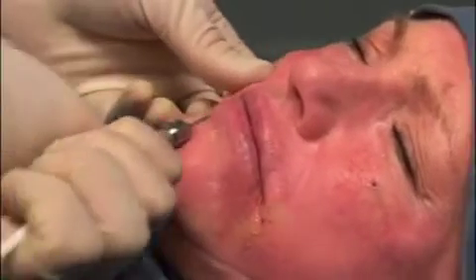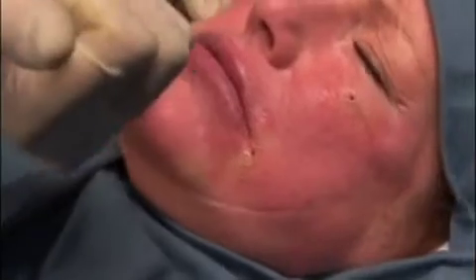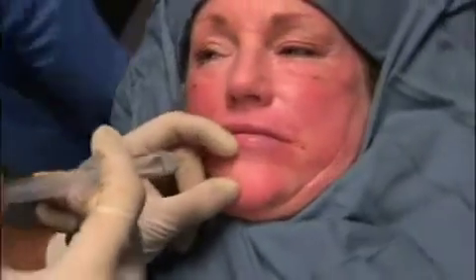It is recommended not to inject more than 1 centimeter in diameter in terms of the quantity of fat in one location. The reason for this is that it enables the fat cells to receive a blood supply before they become necrotic.